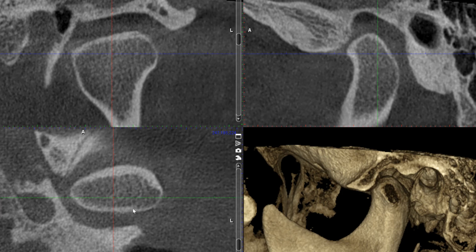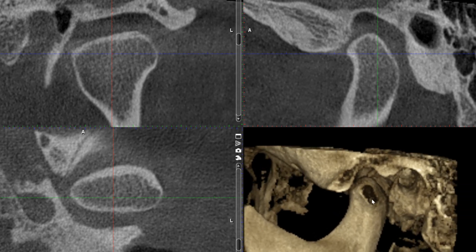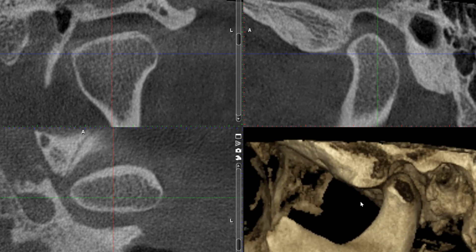Here we have a beautiful limited field of view scan of the patient's left TMJ. Let's scroll through the sagittal section, because this looks very much like what we saw in the panoramic radiograph. But before I do that, let's quickly take a look at the condyle in this 3D rendering view.